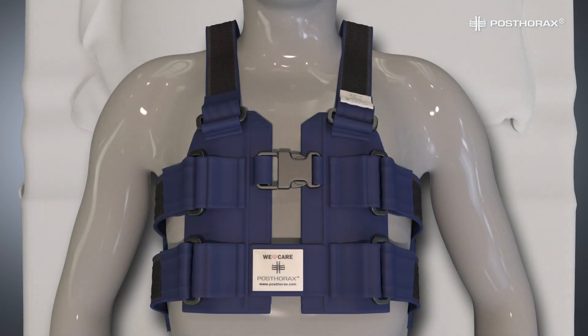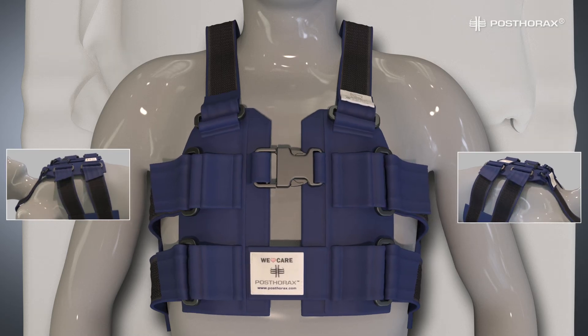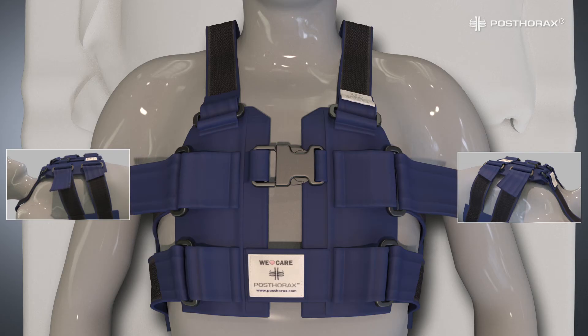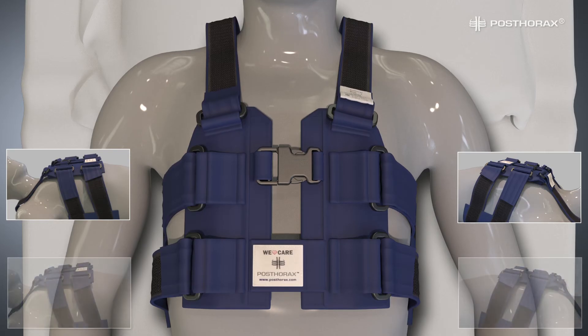Now we will engage the support function of the Postorix vest. Take hold of the upper side straps and ask the patient to take a deep breath to the best of their current ability. When the chest is fully expanded, pull both straps at the same time, equally tight, so that the elastic slack flattens. Now attach the Velcro closure in that precise position. Once the patient exhales, observe the breath and stop mechanics engaging, with the elastic band returning to a position of slack, allowing normal breathing to occur.